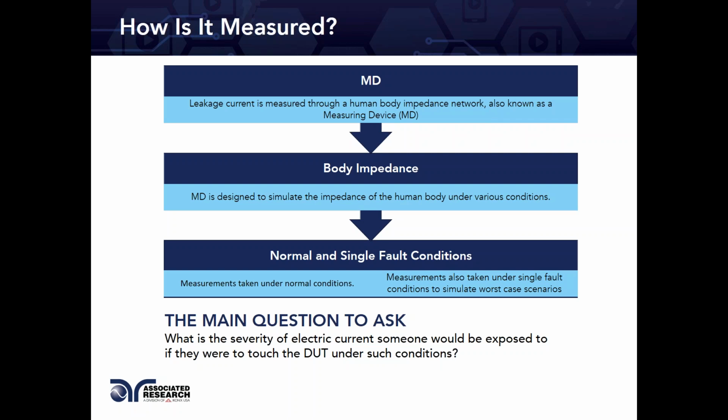If an operator, a nurse, or somebody breaking off the ground pin creates additional hazard for your product to shock somebody. Now, there's also a condition called reverse polarity, which allows measuring of leakage current if the line and neutral were reversed. There's a possibility that the wiring or the plugging in of the product is done in the wrong fashion. This will create a reverse polarity condition where line and neutral are reversed. Does this allow additional leakage current?